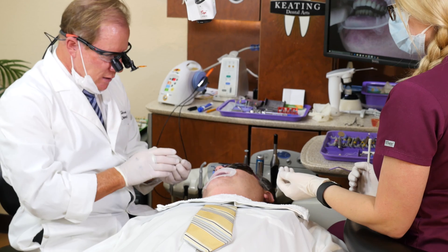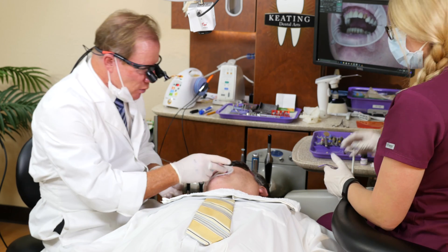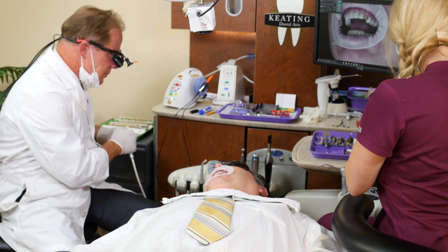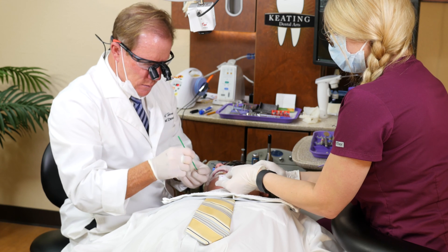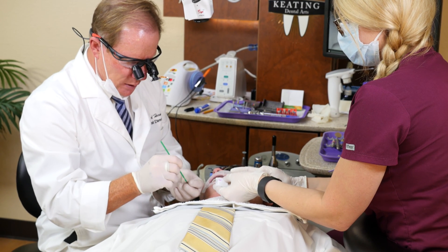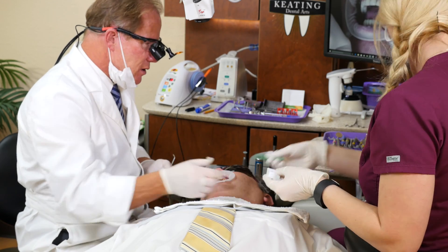We're going to go ahead and bond this into place. Since this is zirconium, we're going to use a cleaner — Ivacline, which is a sodium hydroxide from Ivoclar — to clean the inside. Let that sit for about 20 seconds. That removes any saliva or protein or organic layers that may become contaminants. You do not want to clean the internal of any zirconia dioxide, whether monolithic or layered, with phosphoric acid — it'll inhibit the ability to get a bond to it. We can get a bond to zirconia, so we might as well bond it as durably as possible.